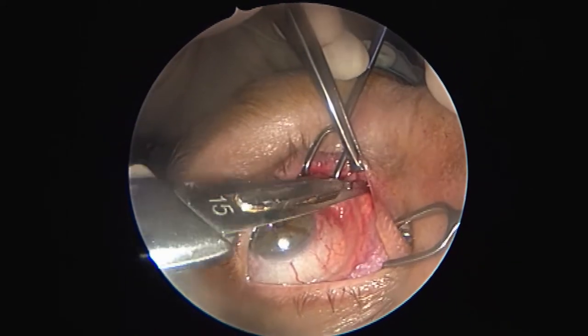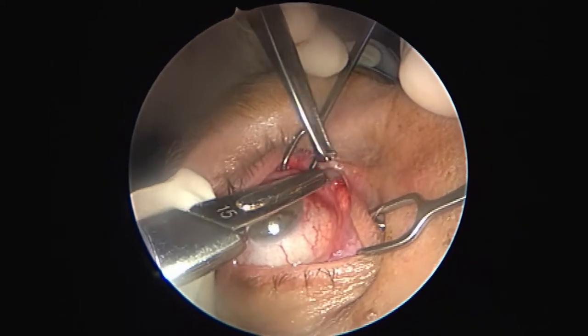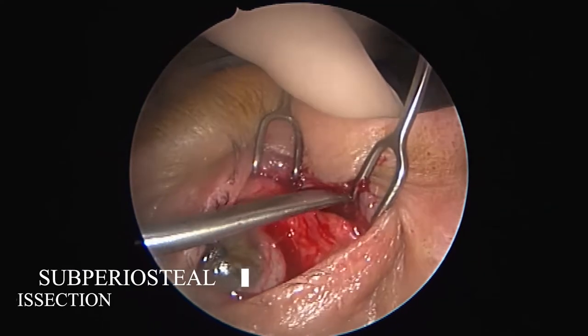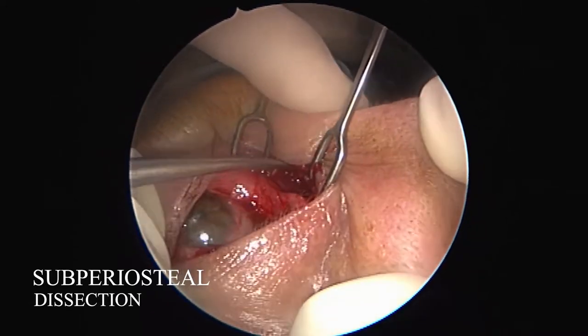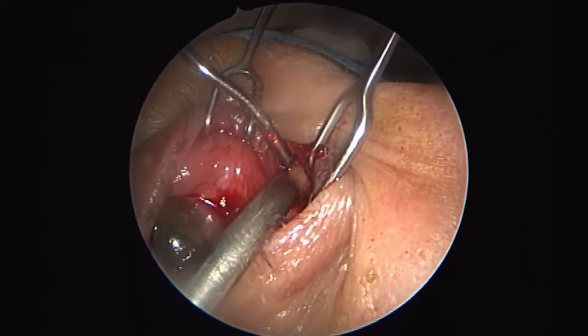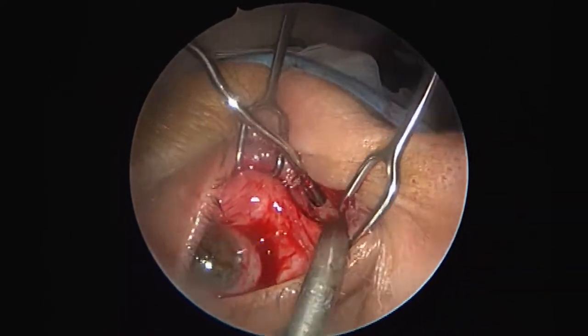The next step is the subconjunctival dissection in the plane between Horner's muscle medially and the orbital septum laterally. The lacrimal sac is always protected by Horner's muscle. Palpation of the posterior lacrimal crest is a good surgical landmark, giving the general direction of the dissection. Once the periosteal level is reached, it will be incised vertically behind the posterior lacrimal crest.